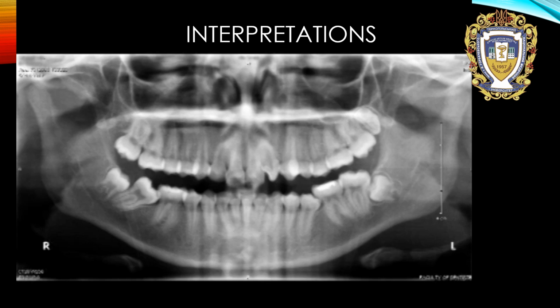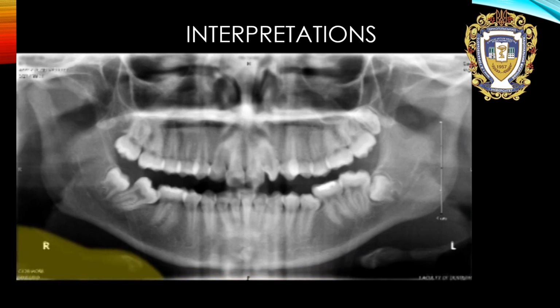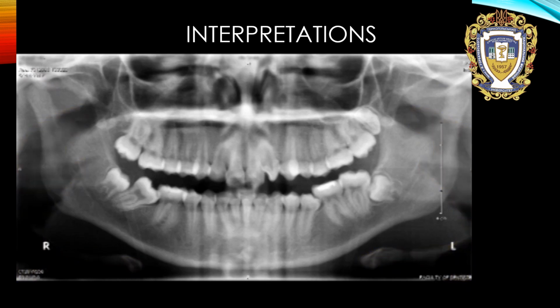Begin by assessing the periphery and corners of the image. This is a good habit because often observers are too occupied with looking at the center of the image, zoning in on the teeth and jaws, and the outer edges of the film are neglected. In these areas, the orbits and the skull base, including the articular process of the temporal bone, are assessed, and the contents of the neck, including the pharynx and hyoid bones, are seen. The cervical spine, styloid processes, and any calcifications in submandibular glands may also be present, but are not captured in this image.